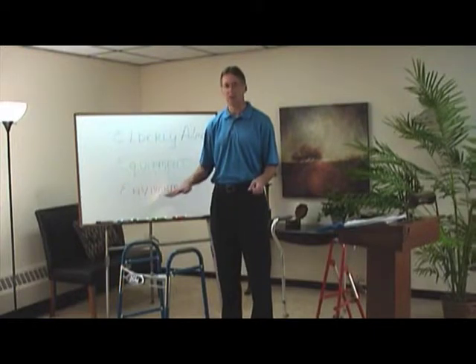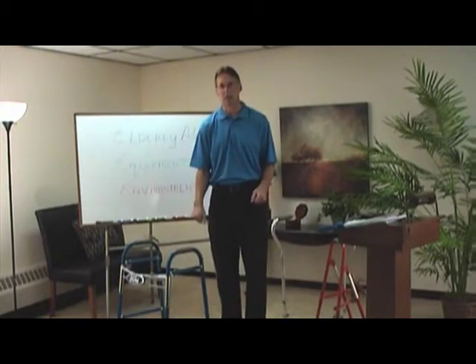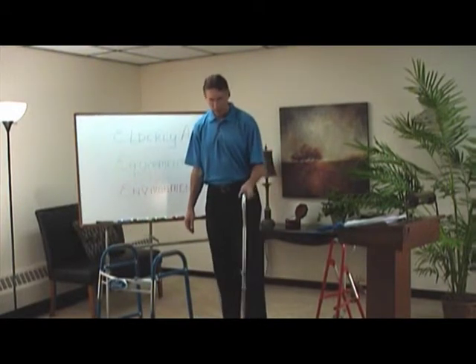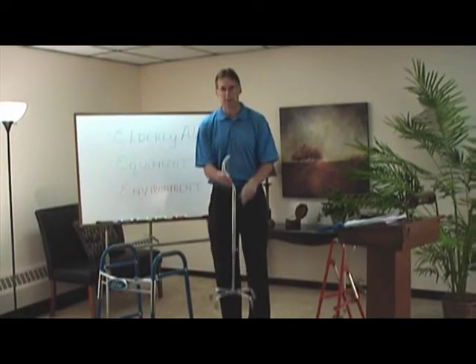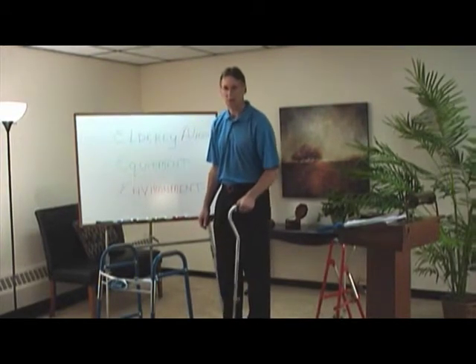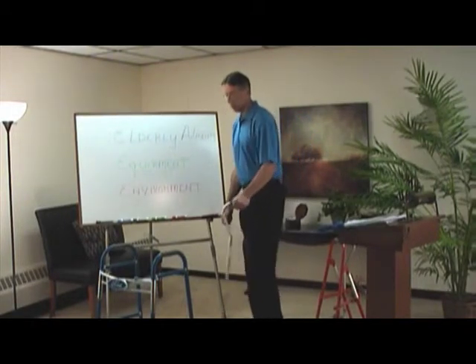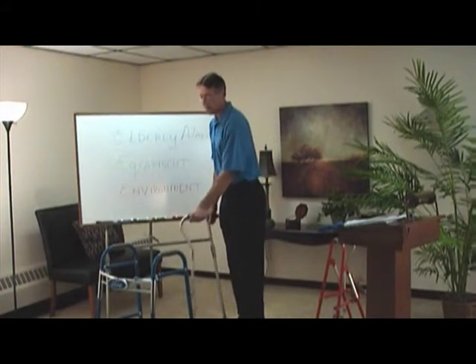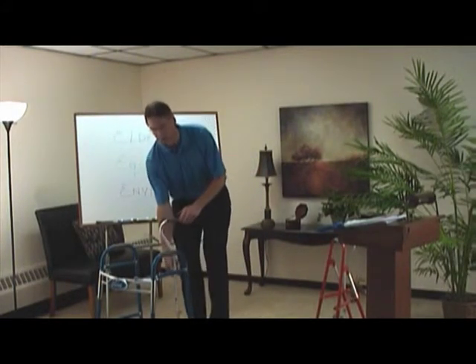So the one with 4 wheels, if you have enough balance for it, is very nice, and as you know, a lot of them have built-in seats now. So you have the brake system on there, you can put the brake on and sit down into it, and they're kind of the Cadillac of the walkers right now. What's nice about this versus a regular cane is that it doesn't fall over on you. You're going to find out canes are always falling over on you and you're trying to pick them up or set them up. What I don't like about this, though, is that when you're walking, and you might not be able to see the bottom of this, it's always kind of unstable. Unless you're a slow walker and you're really deliberate, it's just an unstable base that you're always trying to find the stability point on.